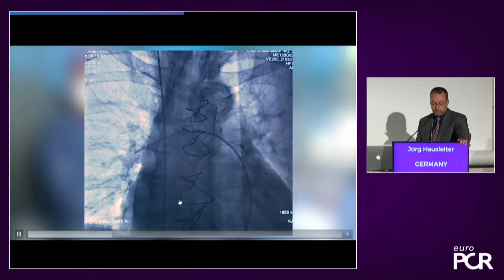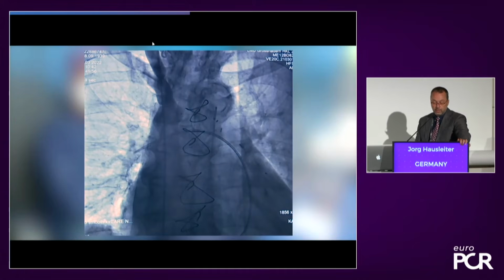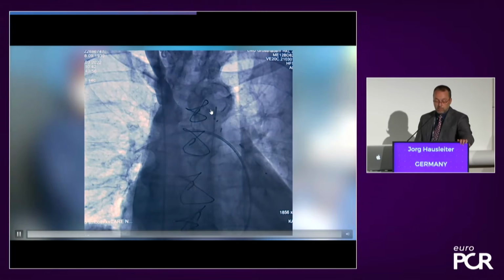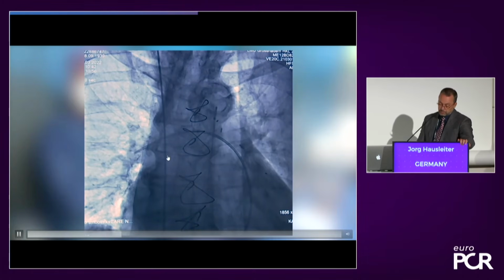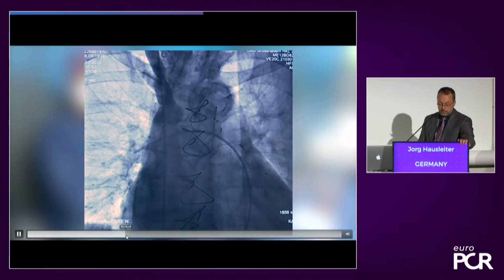also a vein access. Now we're placing here the pulmonary artery catheter in the right pulmonary arteries, which serves us also as an anatomic landmark. And I'm doing injections here into the right jugular vein, and you see here the flow of the contrast in the superior caval vein, and you can also appreciate here the confluence of the innominate vein. So we don't want to obstruct that vein with our stent. Now, the fluoroscopy is very helpful for the placement of the first stent, as you will see in the second.